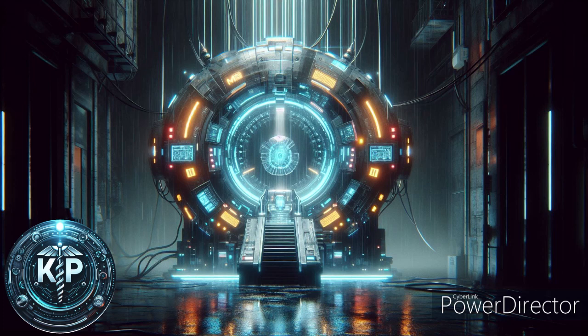RF, radio frequency coils. These coils transmit radio frequency pulses into the body to disturb the alignment of the protons. When the RF pulse is turned off, the protons return to their original alignment, releasing energy that is detected by the RF coils. This signal is used to construct the image.